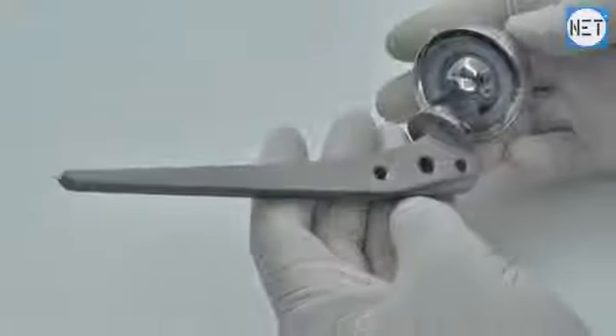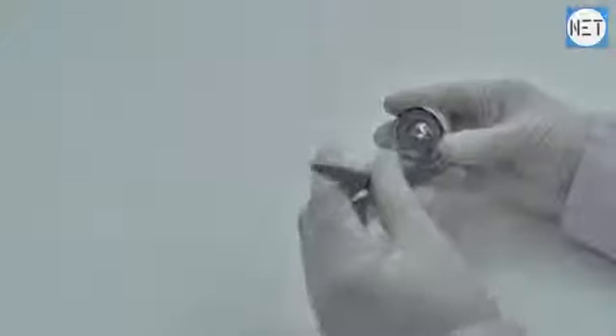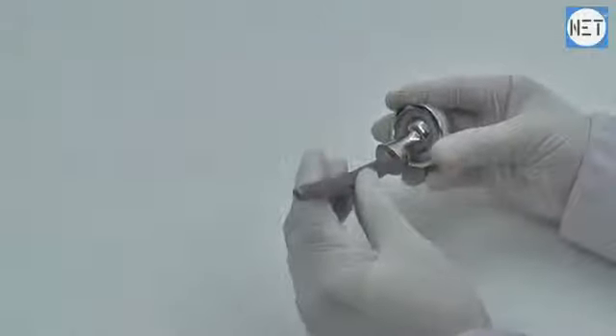The advantage of bipolar hemiarthroplasty is to decrease the acetabular destruction by preventing rubbing of the prosthesis against it. In bipolar, while the patient walks, the prosthesis facilitates its own movement, thus no damage is done to the acetabulum.